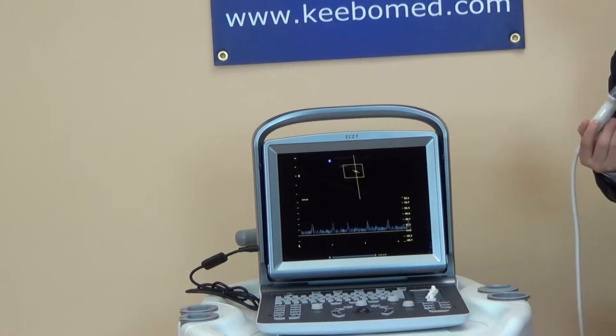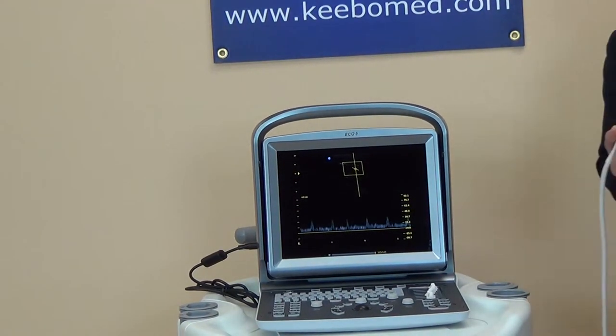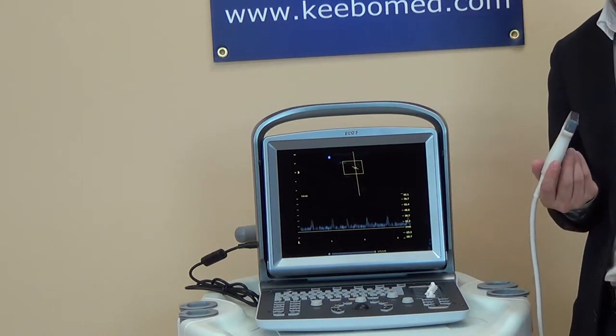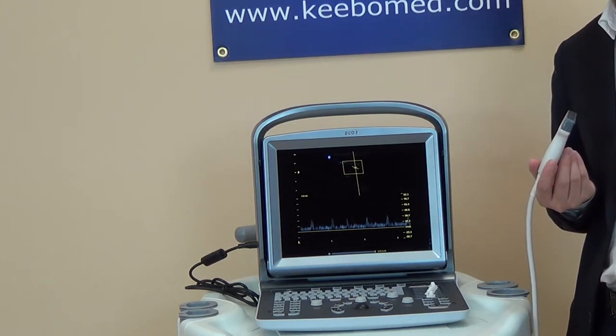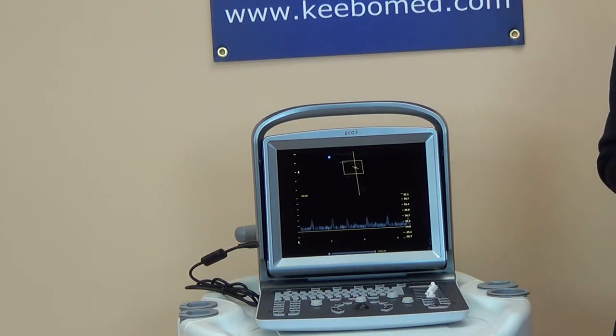So this is called 'one key for screen,' to make the doctors look at the image more clearly. This is also one of our big selling points for this model.